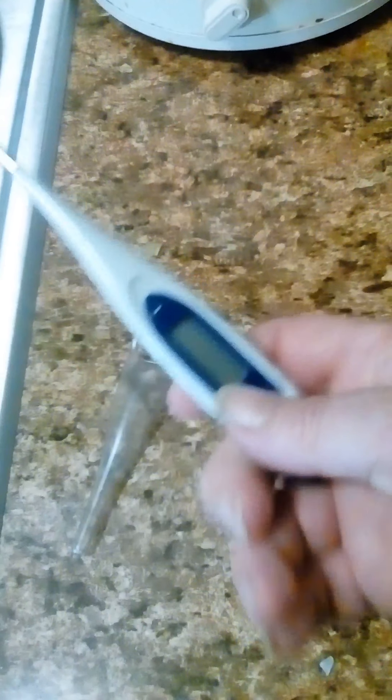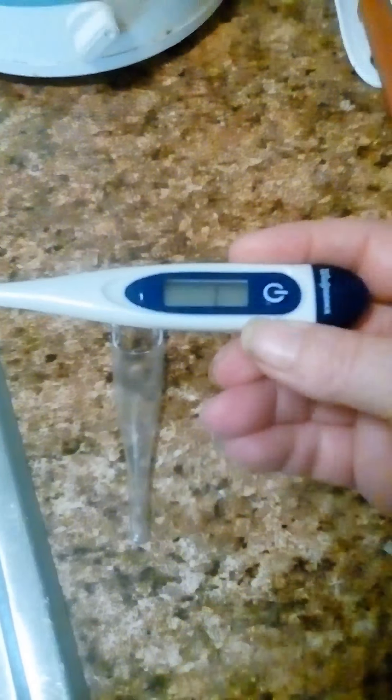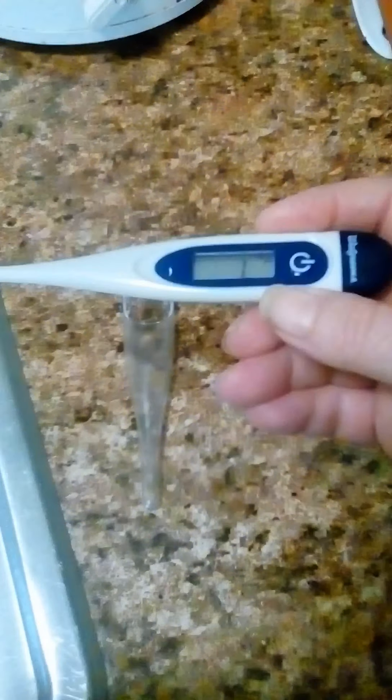To get it started, all you got to do is push the button here, and stick it in your mouth — or whoever's temperature you want to take — and get a reading on it.